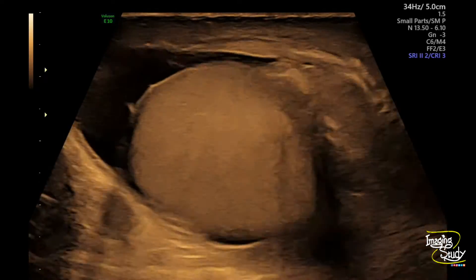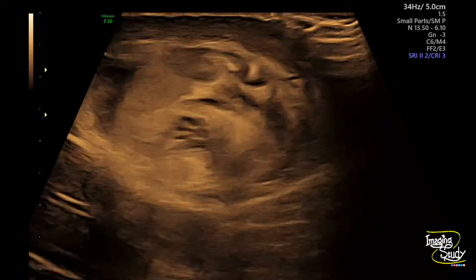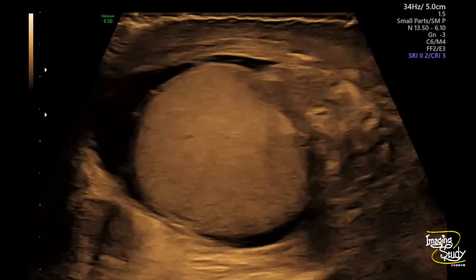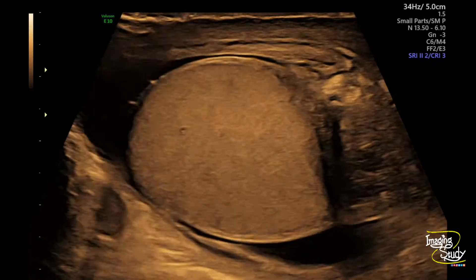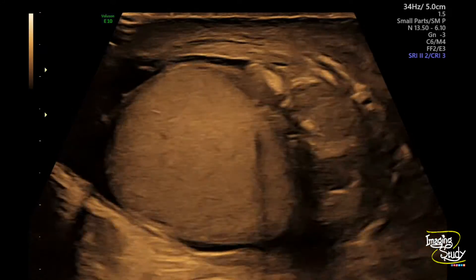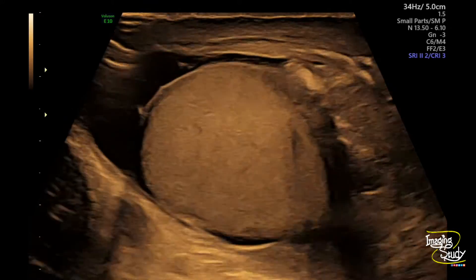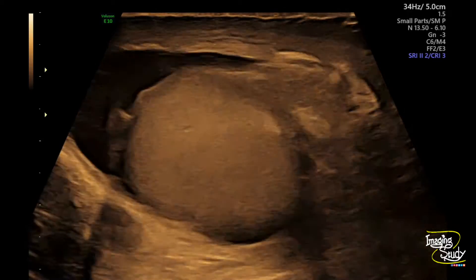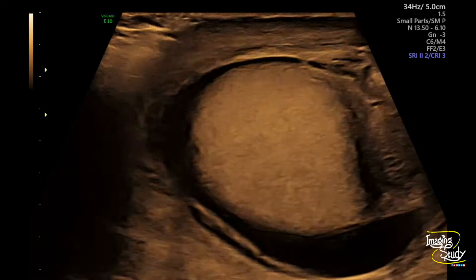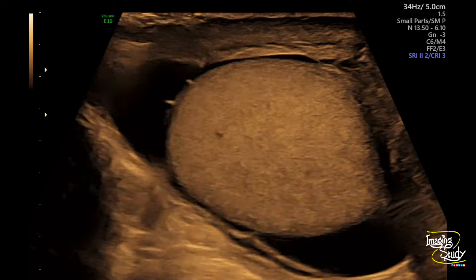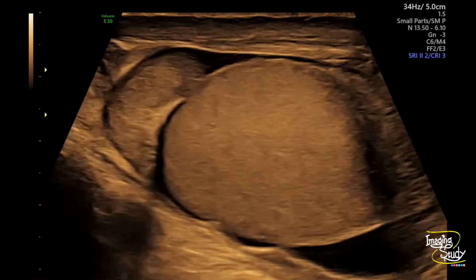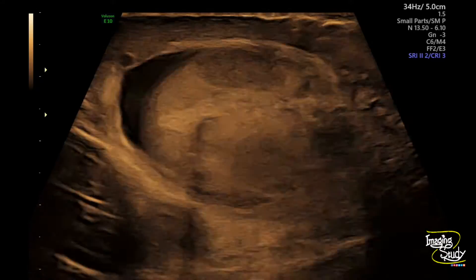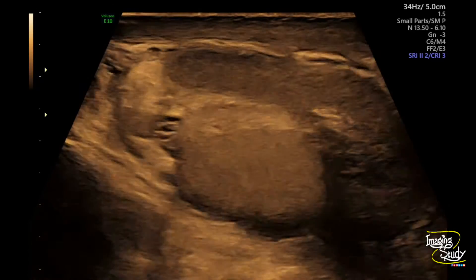We have recently posted a video about testicular torsion. If I tell you that this is a testis and epididymis of a torsion case, you cannot deny it seeing only this grayscale image. So whenever you are scanning the testis, you should use color Doppler to make a conclusion.